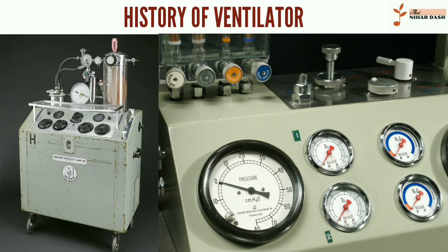Mechanical ventilators began to be used increasingly in anesthesia and intensive care during the 1950s. Their development was stimulated both by the need to treat polio patients and the increasing use of muscle relaxants during anesthesia. Relaxant drugs paralyze the patient and improve operating conditions for the surgeon, but also paralyze the respiratory muscles.